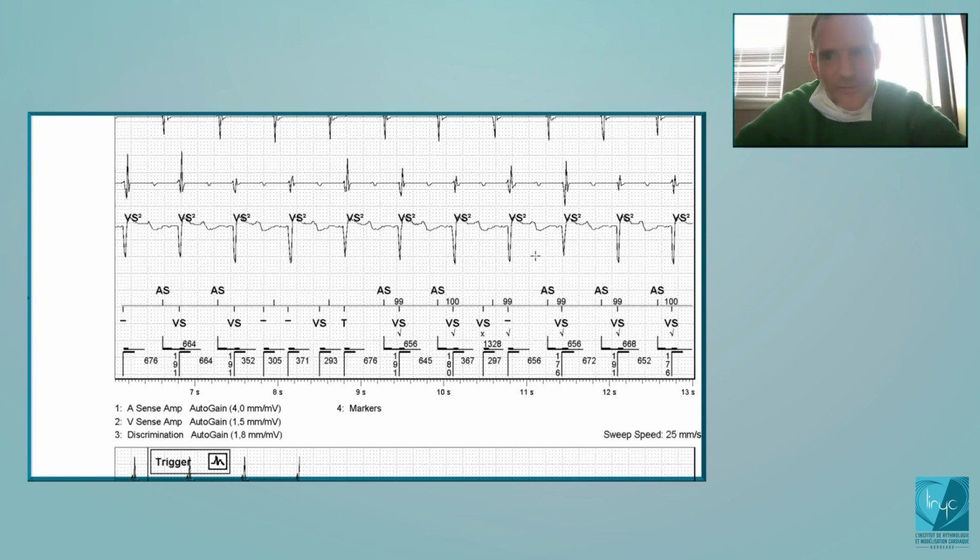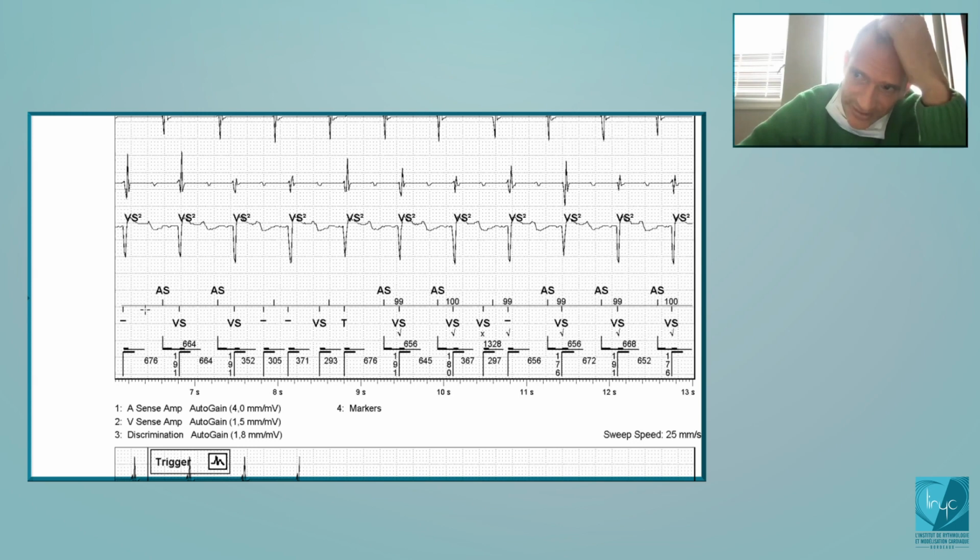Okay. Are there any questions? What I wanted to explain is that the way you are classifying the cycles in Abbott is completely different compared to all the other ones. In these devices, you always compare the current interval and the average value. Okay, so that's a major difference. The major advantage is that I think this is the company where the risk of not treating a VF because of undersensing is the lowest compared to all the other ones.